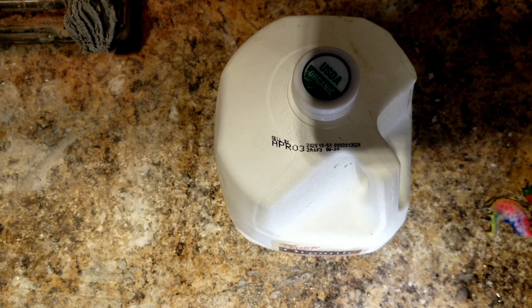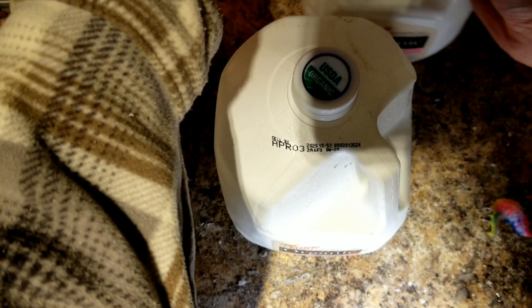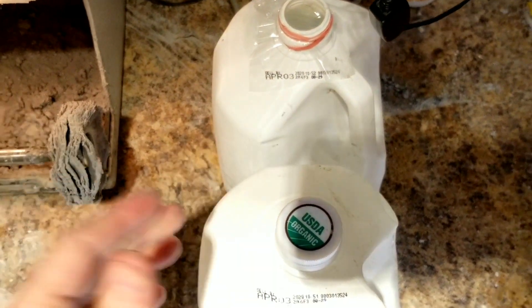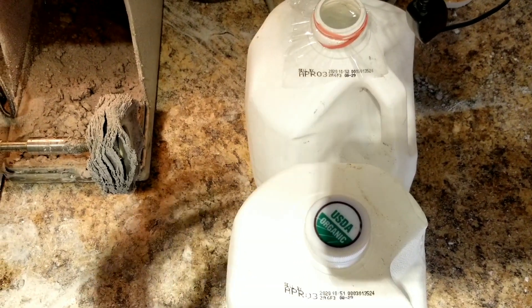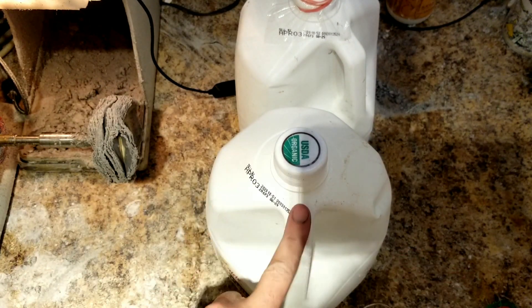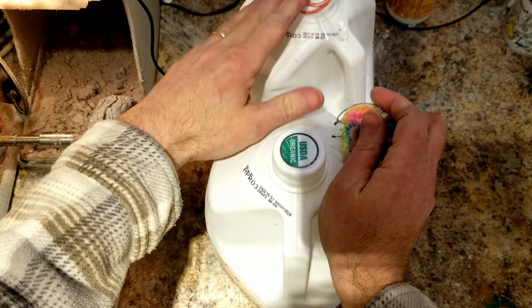What's better than one gallon of milk is two gallons of milk — or I should say two gallons of water. I put the water gallons back to back, and there's a reason why. Just wait. These two gallons touching are full of water.